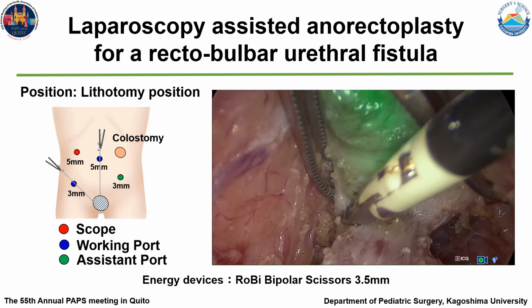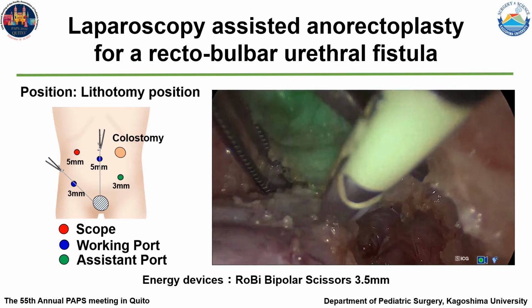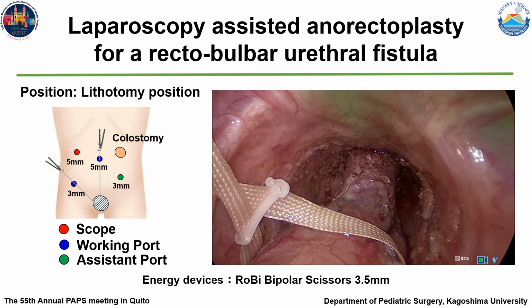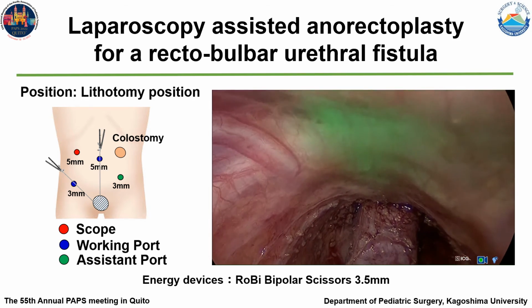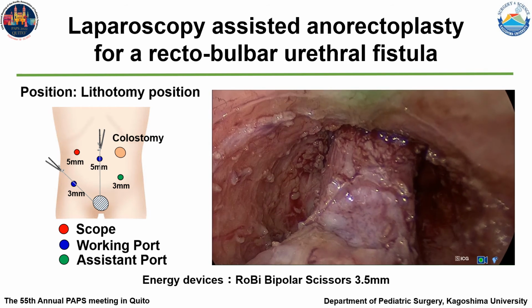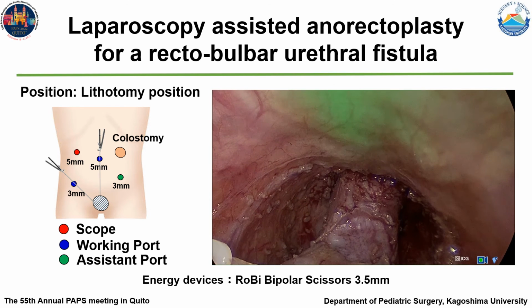Before starting rectal dissection, a 6 French pigtail type NIRC was inserted through the external opening of the urethra to visualize the urethra during the procedure. While dissecting the deep pelvic space between the posterior wall of the urethra and anterior wall of the rectum, the exact line of the urethra was clearly visualized by overlaying images from the NIRC. Dissection of the RUF was performed safely using this innovative image-guided technique.